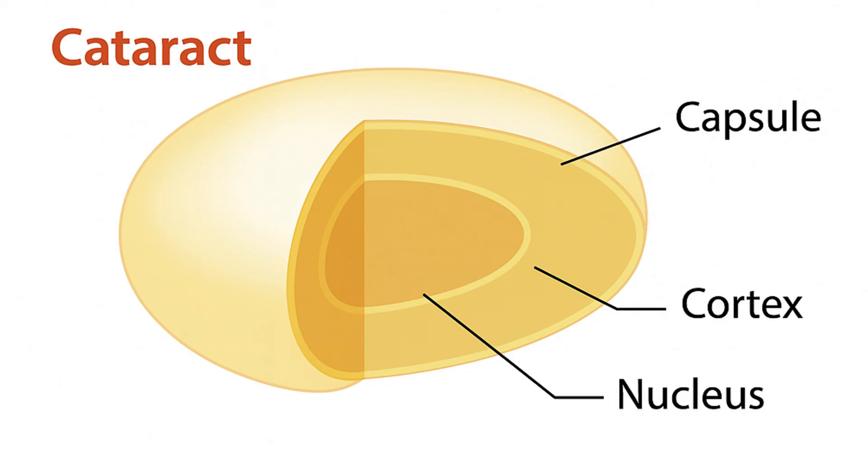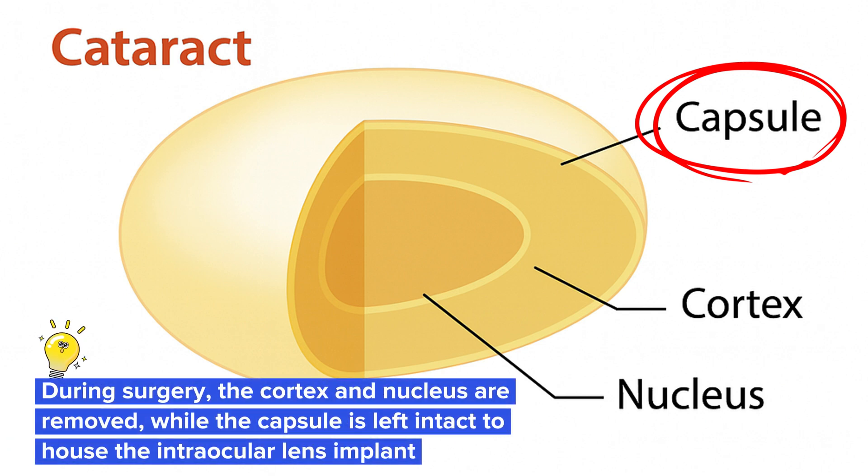A lot of surgeons will use the analogy that a cataract is similar to an M&M. It has a thin outer shell, which is the capsule of the cataract, and then the inner chocolate portion of the M&M is the actual cataract itself. During the surgery, we'll remove the core of the cataract and then leave the outer shell, which is the capsule. And then we'll place the artificial lens inside that capsule.